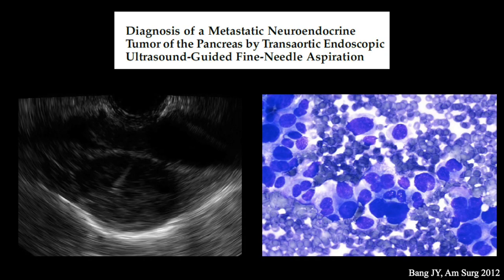In a prior report from 10 years ago, we have reported on the safe performance of transaortic FNA via the esophagus in a patient with suspected tumor in the posterior mediastinum that was proven to be a metastatic neuroendocrine tumor. However, successful outcomes are strongly reliant on following the checklist outlined earlier.